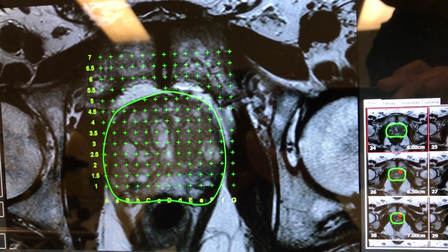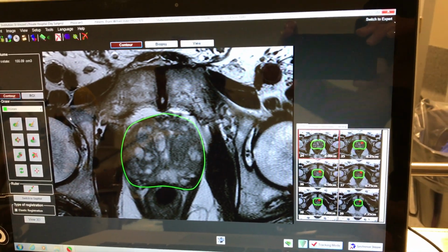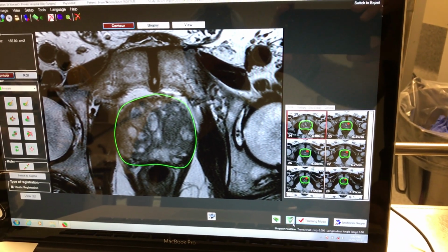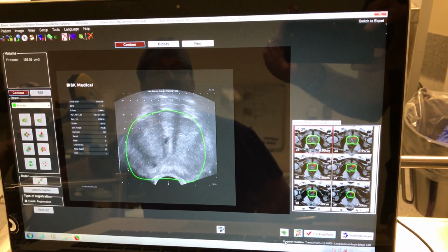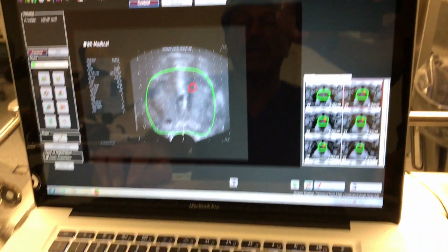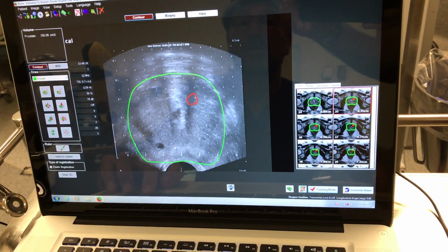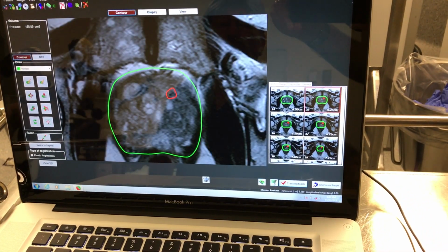And then what we'll do is just run through by moving the scroller here, and as we do that, in fact what we will do is just make it a little bit bigger. Just double check again that we've got that.